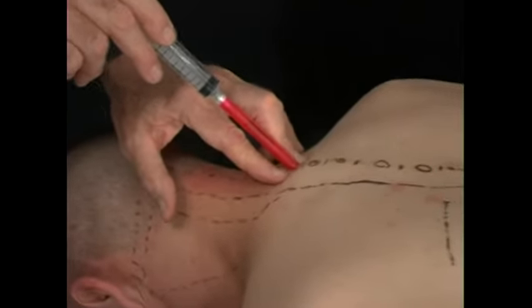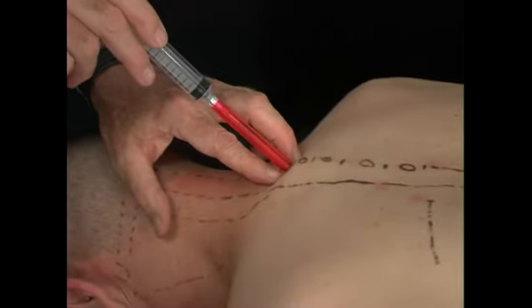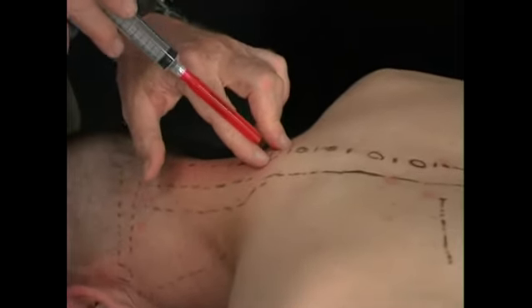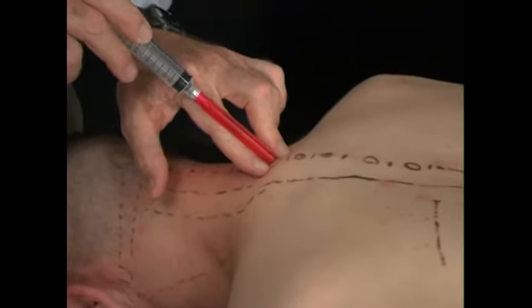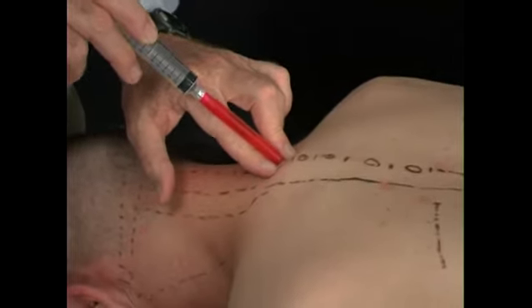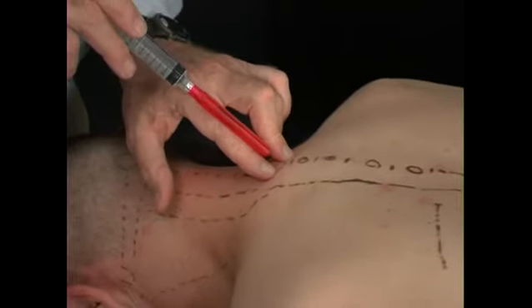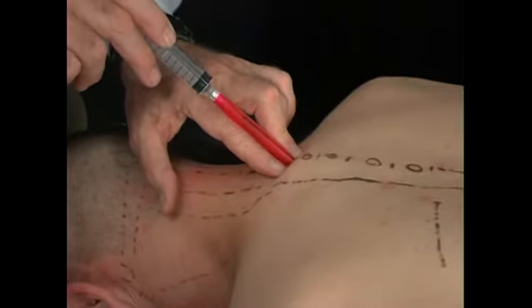And here we have much looser skin, so that we can slide the skin down and actually go into the interspinous area with one injection site. But again, it's critical to come out to the area of the skin rather than out of the skin, but above the fascia. You'll sometimes feel the needle pop out of that area. Other times, if you try to slide, the needle will bend if you're still in the fascia, and if you re-inject, you'll go down in the same hole. So it's important to get the needle out far enough before you do your next injection down into the interspinous area.